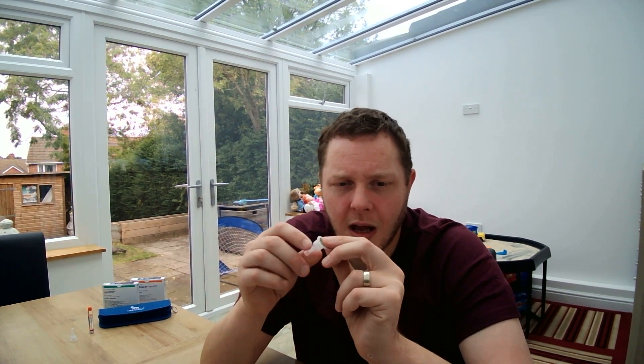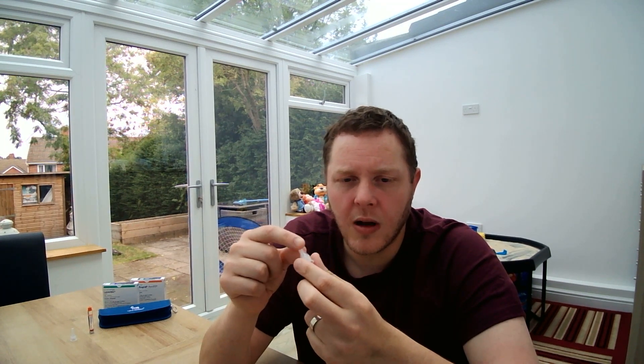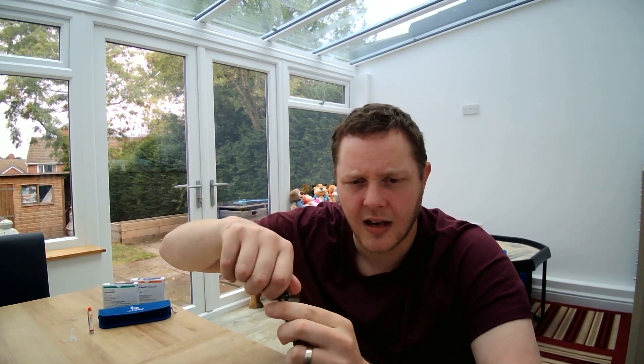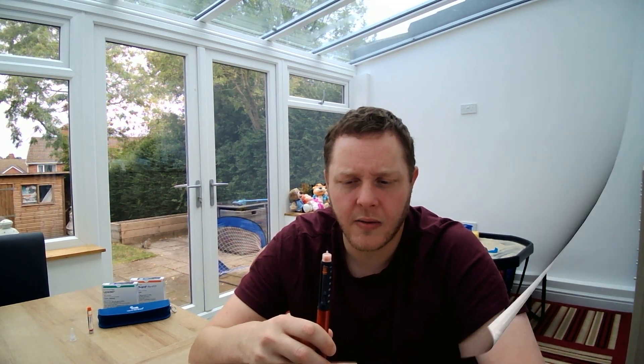Let's have a look at the needle and then connect it to the pen to do our air shot. You've got the paper tab at the bottom — just peel that off. You've got the outer needle cap, and then inside you have the inner needle cap. So we're going to take off the paper tab, connect the needle onto the pen, and twist until it's fully secure. Then take off the outer needle cap, and then the inner needle cap, and you'll see the needle itself.